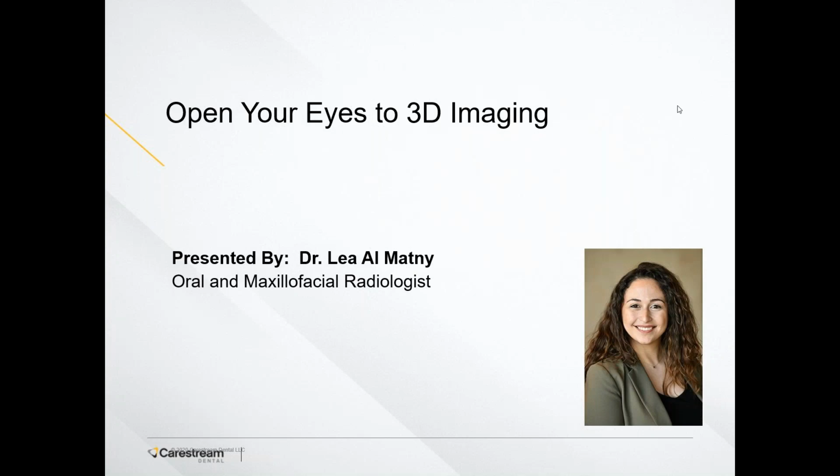It's going to be presented by Dr. Lea Al Matny. The goal of this webinar is to recognize when and how to implement three-dimensional imaging to approach cases in a comprehensive manner and help establish an accurate diagnosis before creating a reliable treatment plan. We will review different cases varying from implant planning, odontogenic and non-odontogenic lesions, root resorption, and fracture cases.